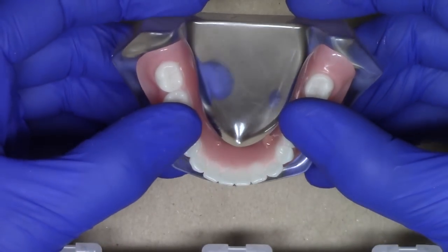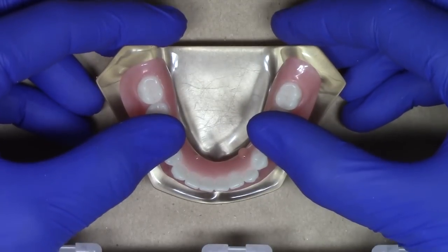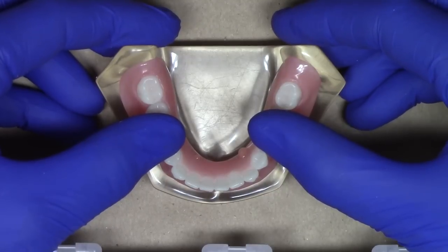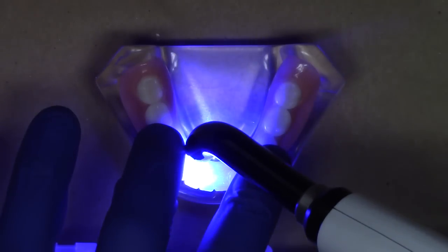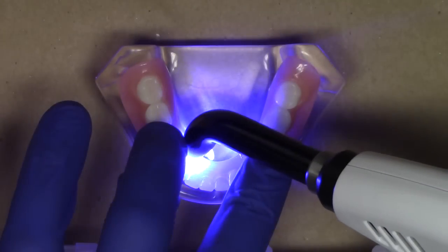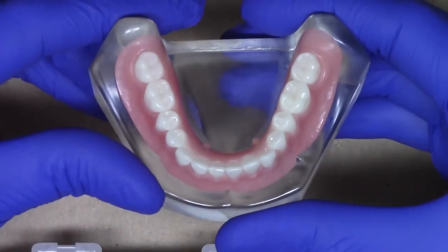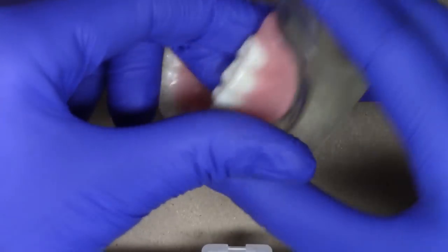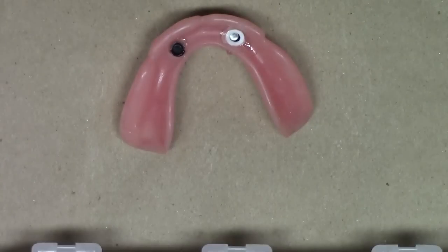The key is that I'd like to see some of that material flowing out the lingual through the vent holes. At this point, we can use just finger pressure from behind the patient for approximately four to five minutes, or we can accelerate that with the light cure option of the chairside material. I'm using the light curing feature of the chairside material just to accelerate the set of the chairside APM. Now my material has fully polymerized and I can go ahead and separate my denture from the model — nice and snug. I have successfully picked up the two denture caps for the locator overdenture system.